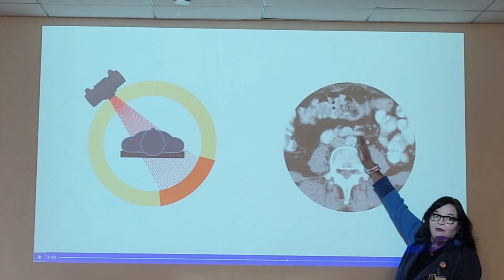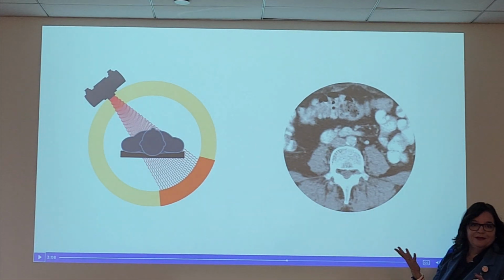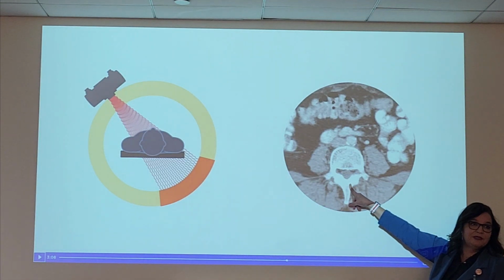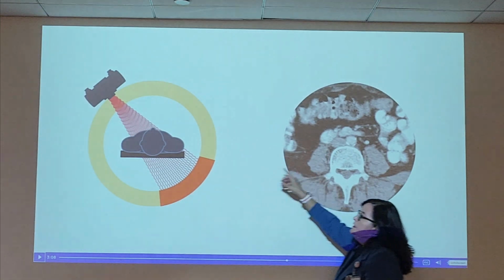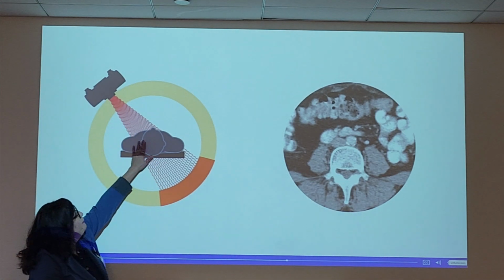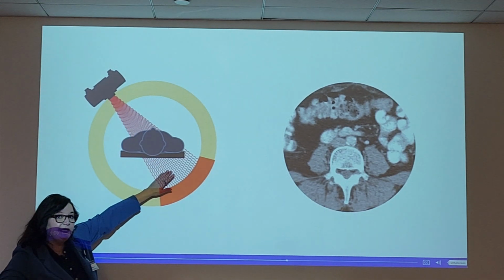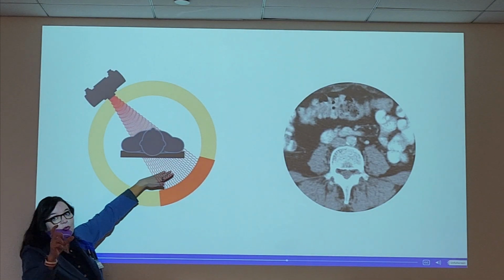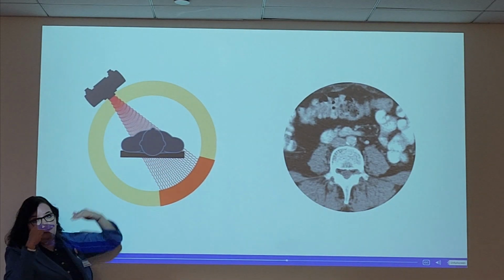But when you paint around it, you can see the outline of what was there and make a distinct visualization. Oh, that was the vertebrae. You with me? Make sense? So, pre-patient X-ray beam, post-patient exit radiation or remnant beam. Exit radiation or remnant beam. They're synonymous.